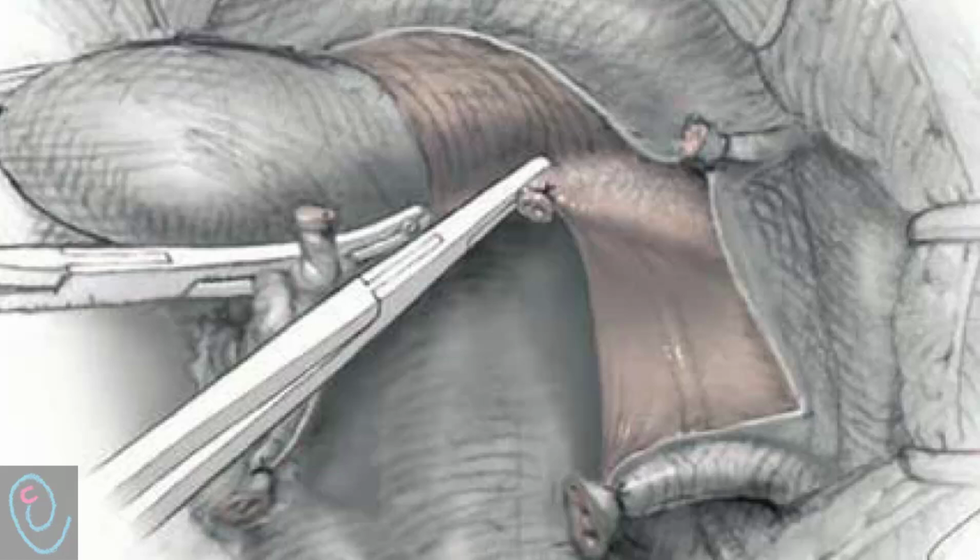Depending on the ligament length, the previous step may be repeated several times. The suture tail of the uterosacral ligaments may be left long for identification to allow later incorporation of these pedicles into the vaginal cuff closure.